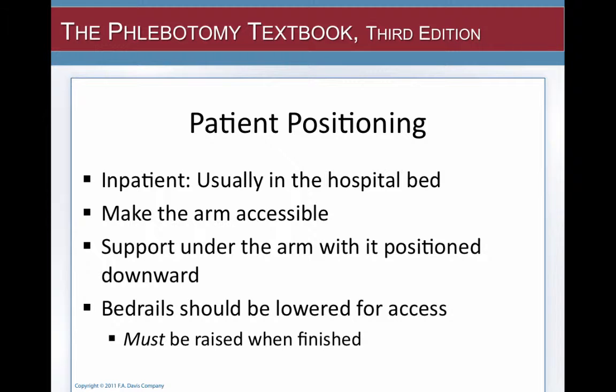You should also bring the bed up to waist level for you so you're not bending over and hurting your back. However, whenever you raise bed rails or raise the bed, you must put them back to where they were when you started. In other words, if you put the bed rails down, make sure you raise them when you're finished. If you raise the bed up, make sure that you lower the bed back down when you're finished.